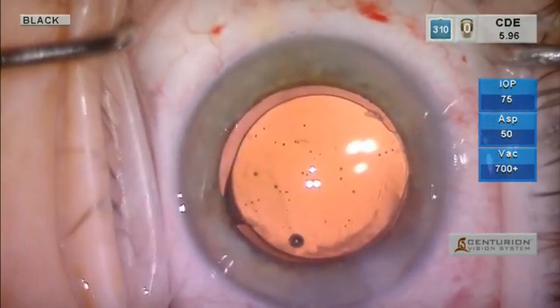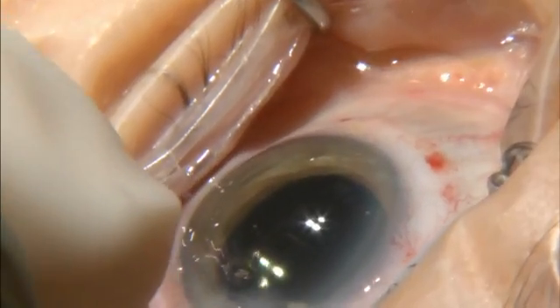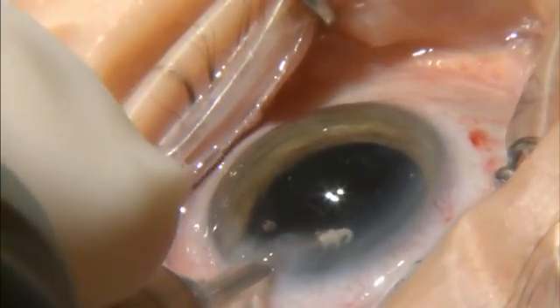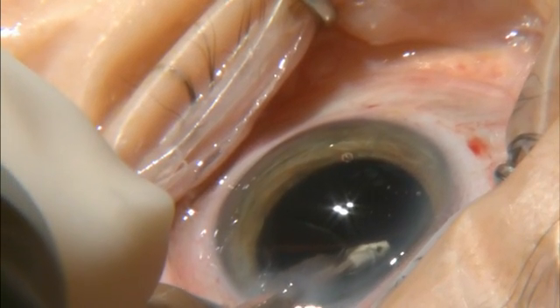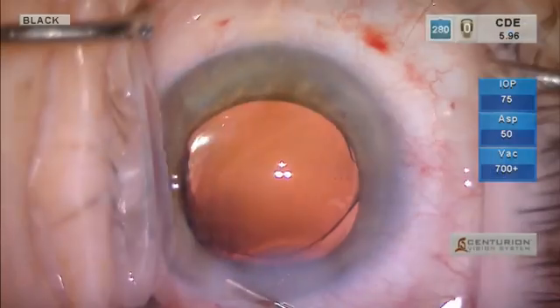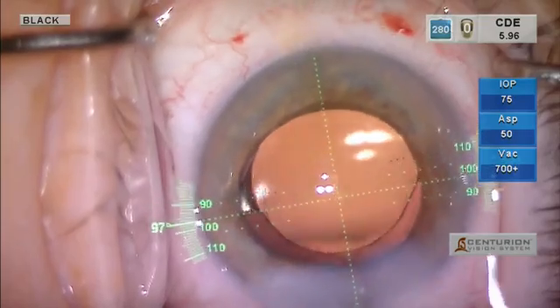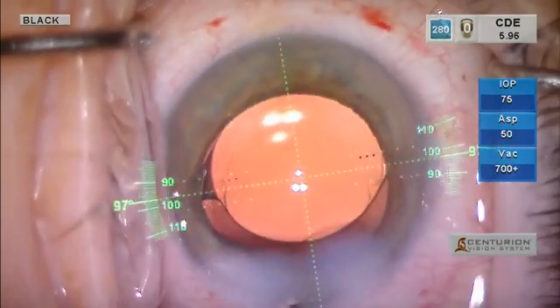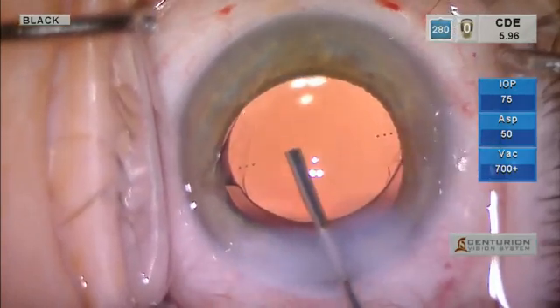We then go back in with our polymer tip IA. I am a big proponent of going underneath the lens to remove all the viscoelastic, especially with toric lenses. I will go ahead and hydrate the incision and make sure we manipulate the lens back into the capsular bag.